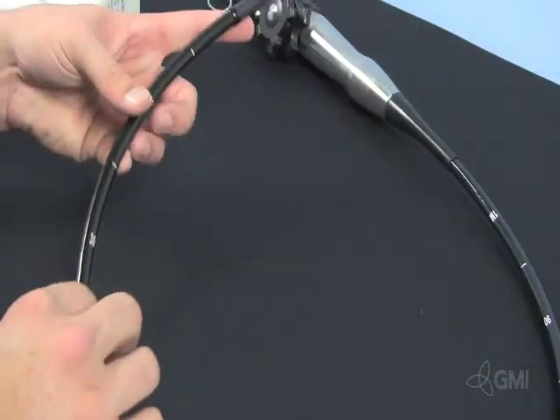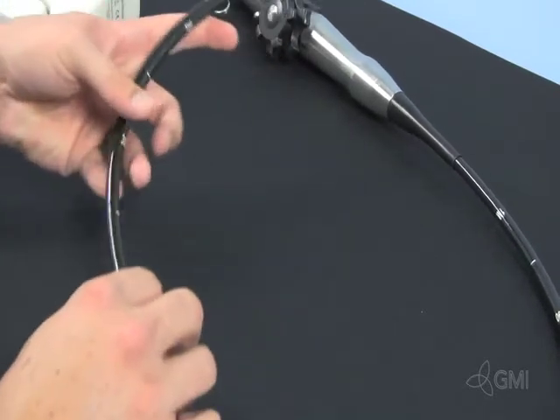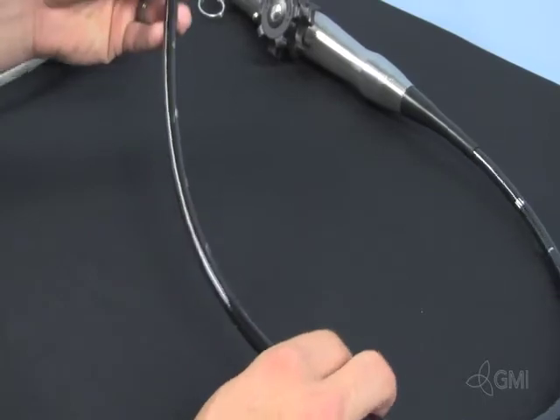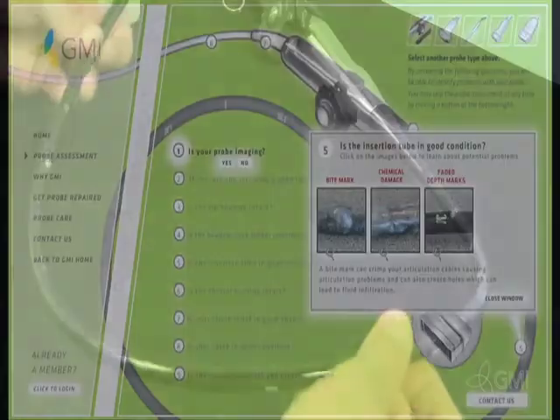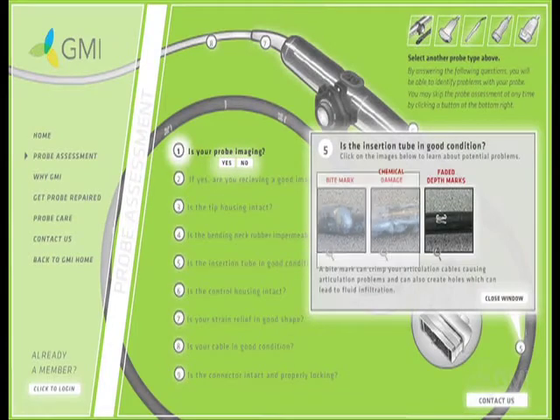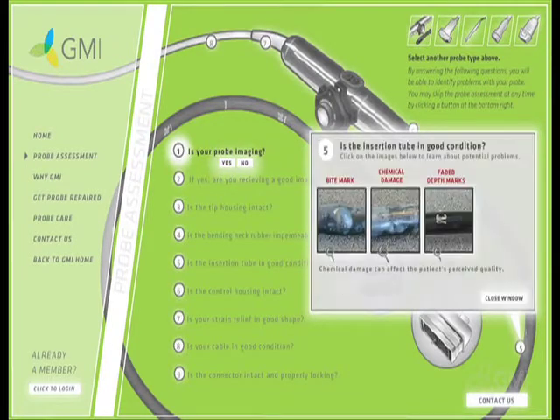Next is the insertion tube. Check for bite marks and chemical damage, which is usually due to Cidex and over-soaking the transducer. Chemical damage can cause the probe to yellow and decay. TEE probes should have a shiny coating on the insertion tube.